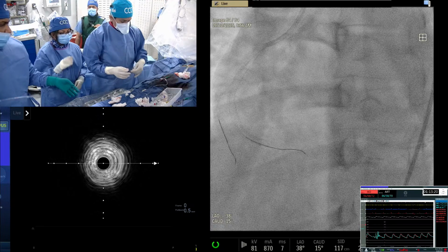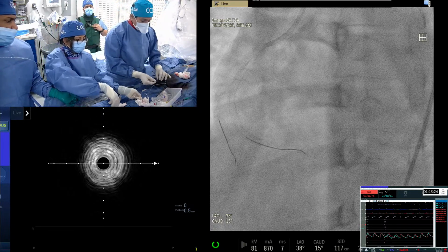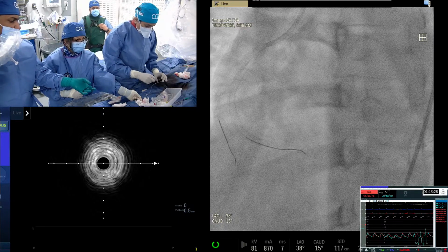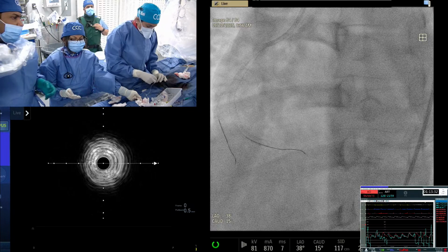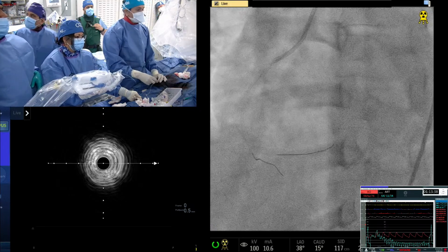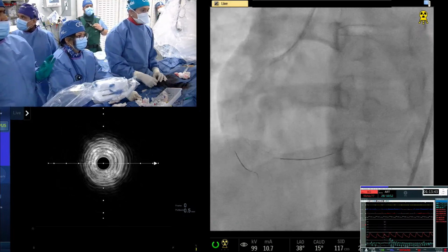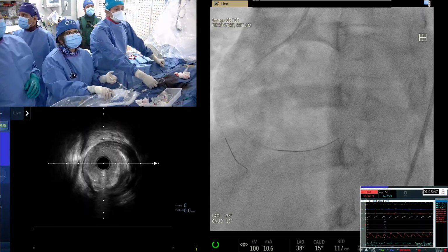So you open the side branch? Yeah, the RV branch was a large branch, but was occluded. Despite I was trying to avoid the two stent overlap at that place, but for whatever reason it was occluded. I recrossed it, opened it with a 2.0 balloon. We post-dilated the stent, and now we have the IVUS ready. But the overlap was not at the level of the RV branch, was it? No, it was not. Check the image. And our guide is out. Okay, start pullback. It's coming.